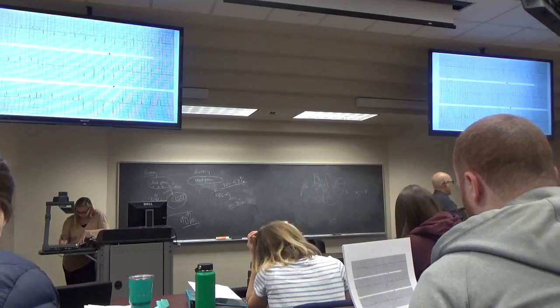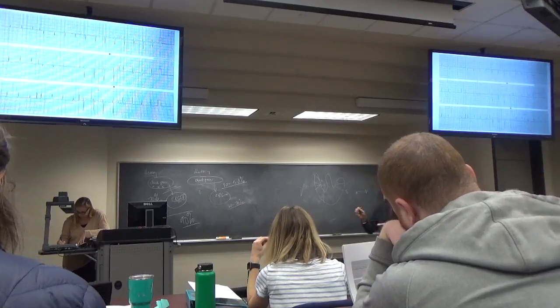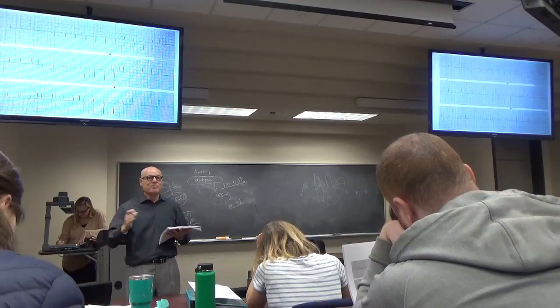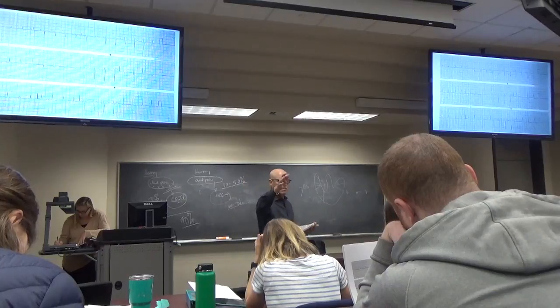Let me reiterate that the EKG is not the test you would order. If you were wondering if the atrium was enlarged, you'd get an echo because you can just measure it. You get dimensions. You see a picture of it. But if it's there, it's reasonable to call.